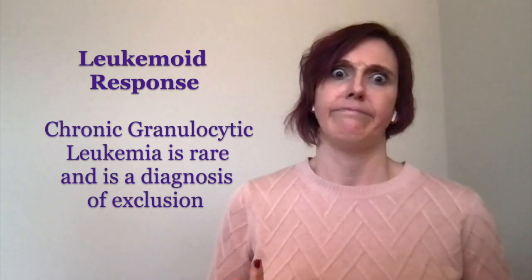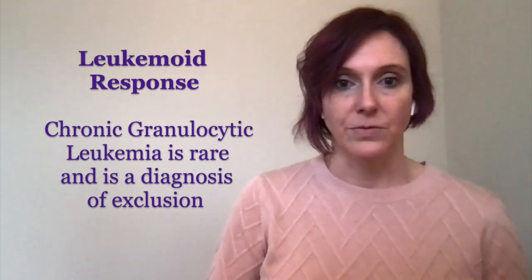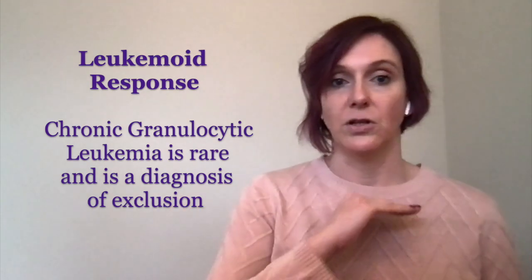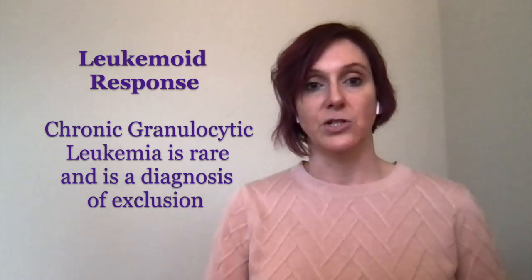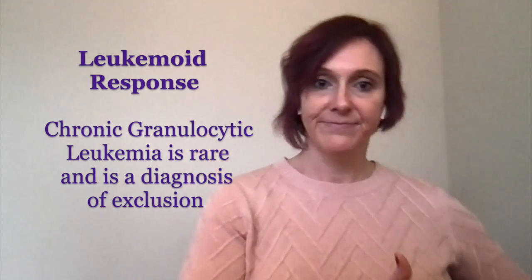How often do we see those? Like, hardly ever. You may catch them in practice from time to time, but it's very much a diagnosis of exclusion. You have to rule out all inflammation. So before we give any patient cancer, let's make sure it's not inflammation.